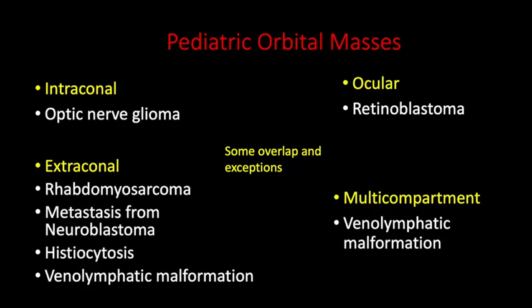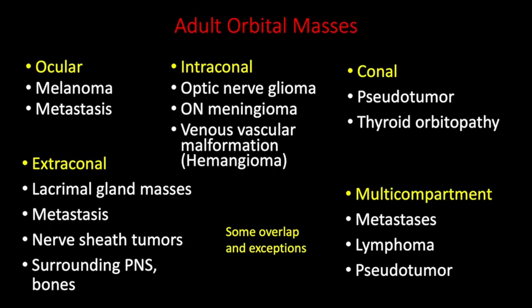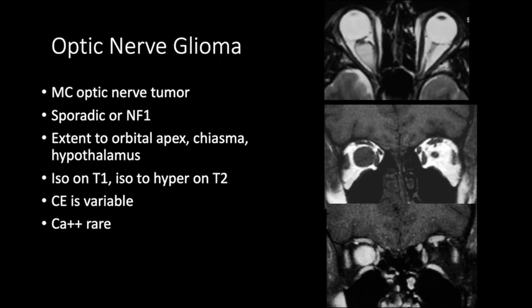These are the common pediatric orbital mass lesions according to compartments, and here are the adult orbital mass lesions. To start with optic nerve glioma — this is the most common optic nerve tumor. It can be sporadic or due to Neurofibromatosis Type 1. When describing optic nerve glioma we should note the extent, whether it extends to the orbital apex, and whether it extends posteriorly to involve the chiasma and hypothalamus. These mass lesions are usually isointense on T1 and isointense to hyperintense on T2. Contrast enhancement is variable — in this case the mass shows intense homogeneous enhancement. Calcification is very rare.